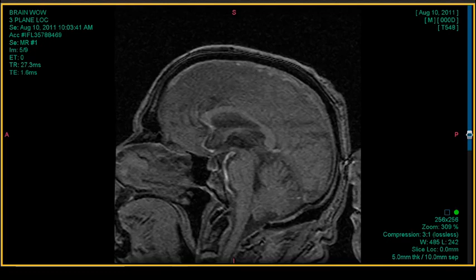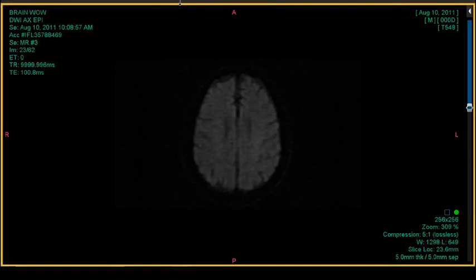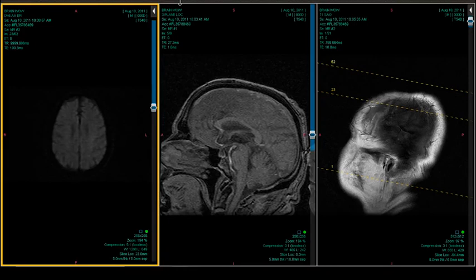Now you can reach up here and pull series down. I'll just explain to them some things they can do. You can hit your keyboard. I like to hit 3. That gives me 3 up. 4 up, they get a little too small for me. So 3 up will just allow you to get oriented here. And then you can start pulling down what you want.